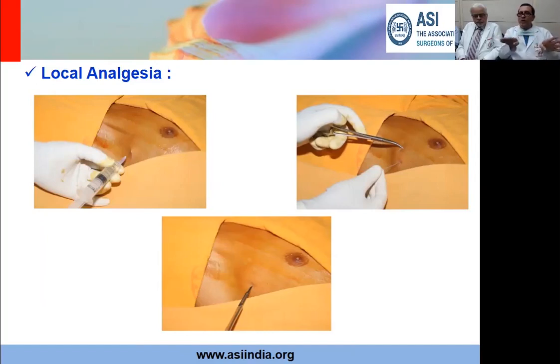And this local should be given over a wide area so that not only at the site of incision but the area surrounding also has analgesia. Many times in a very anxious patient, you can complement it by giving intercostal space analgesia, a space above same space and a space below, which will give you analgesia over a wide area.